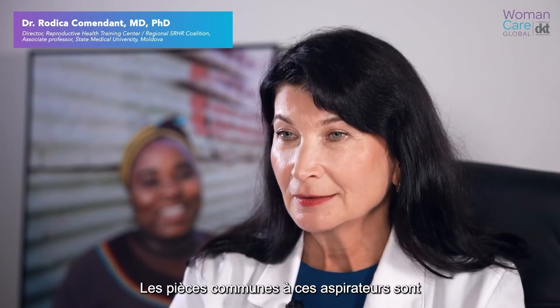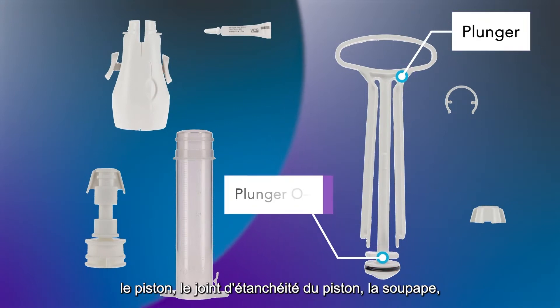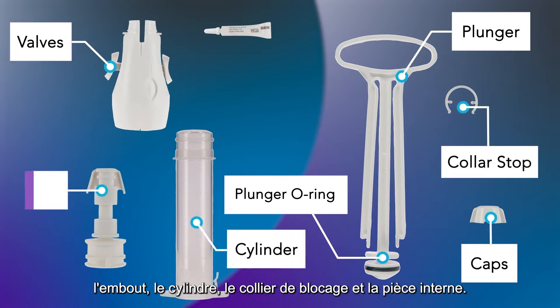The common parts that make up these devices are the plunger, plunger o-ring, valves, caps, cylinder, collar stop, and liner.